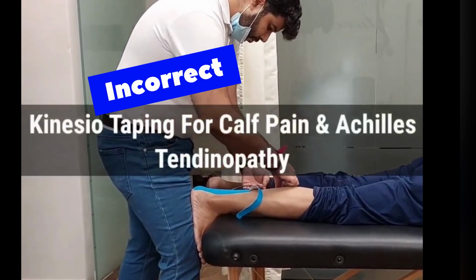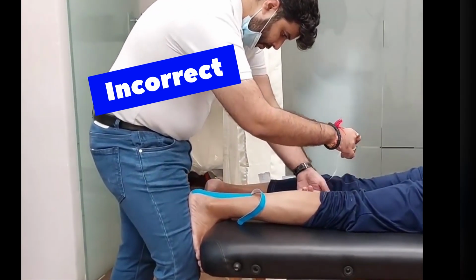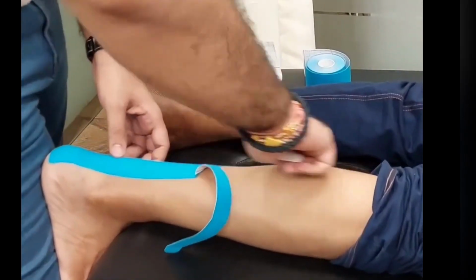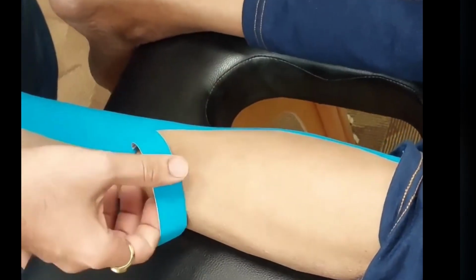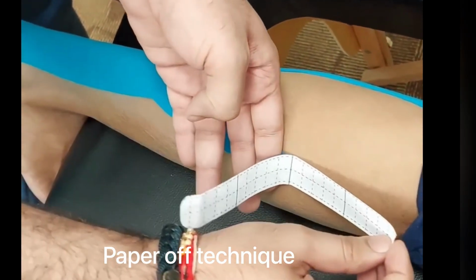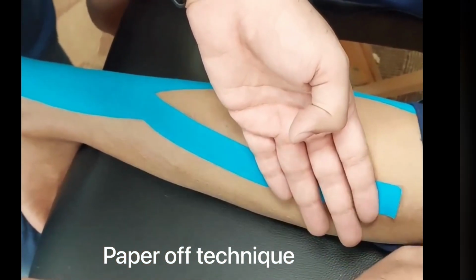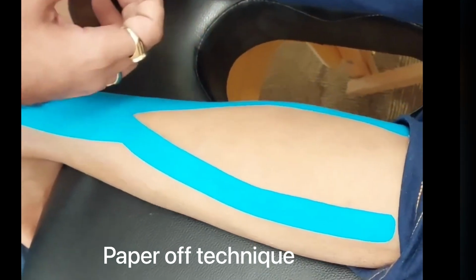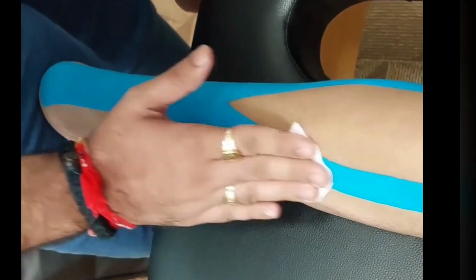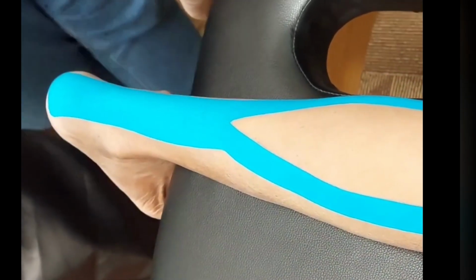So this is the incorrect way of taping the calves. If you look at the stretch percentage applied in this application, it's basically a paper-off stretch percentage, which is incorrect for the principle of the stretch applied to an overused muscle. This is also an incorrect way of activating the glue.